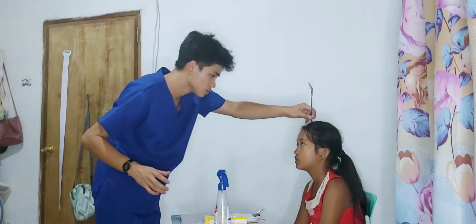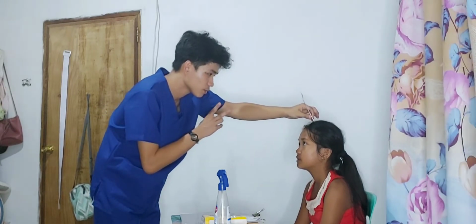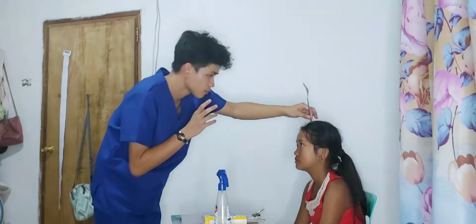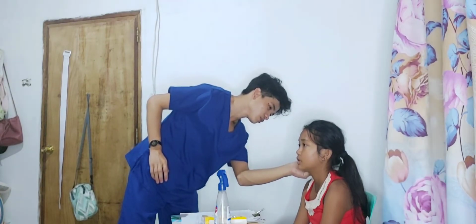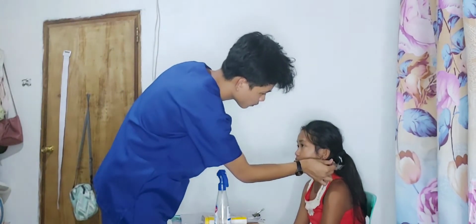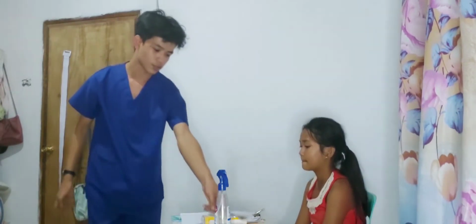So may nafe-feel ka po? Yes. May naririnig ka po? Yes. So both ears po? Yes. Malakas po yung vibration? Yes. Okay. Then, next is the mastoid. So, I'm going to place it to your mastoid, ma'am. So, tell me po if may nafe-feel ka po, naririnig, okay po? Ay, naririnig ka po? Yes. Okay po. Sa kabila naman, ay nafe-feel ka po, naririnig? Yes. Malakas po. Okay.